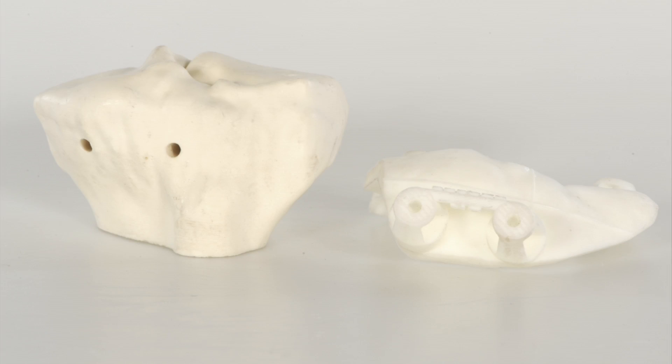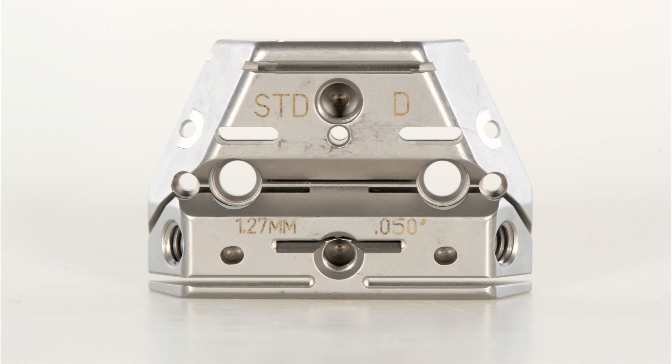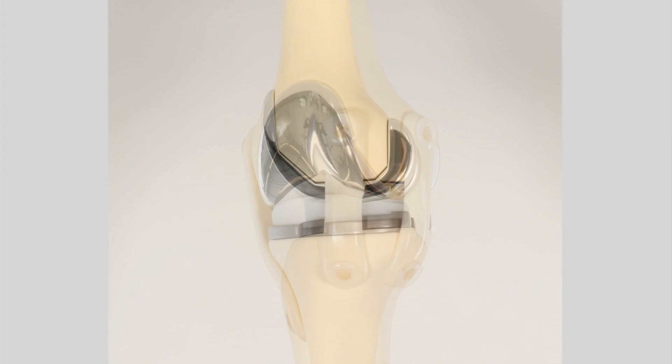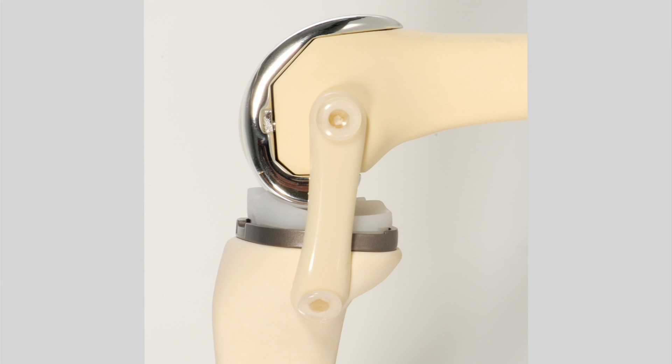During the operation, the moulds are placed on the end of the bones that make up your knee joint, to show us exactly where the cuts are made to prepare for the implants. Tried and tested knee replacements are used with multiple combinations of components. This system allows your surgeon to judge the best fit possible for your knee.